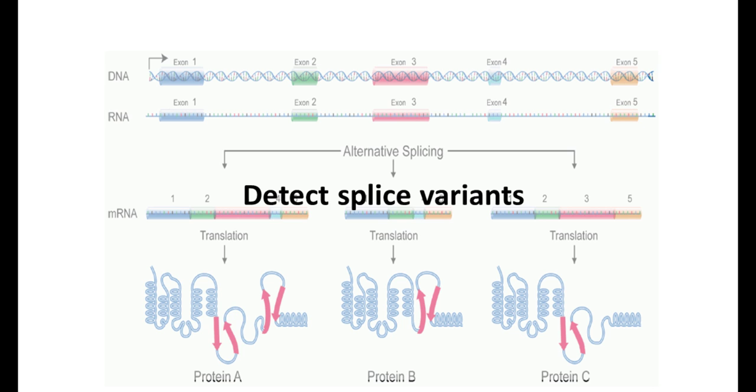So here they saw that in these samples that are mentioned on the screen, they were able to see the expression of the delta 16 HER2 splice variant, the wild type HER2, as well as positive signals for the probe, which spanned both the splice variant and the wild type HER2. But with the HER2 antibody, they were not able to distinguish between these different splice variants and wild type.